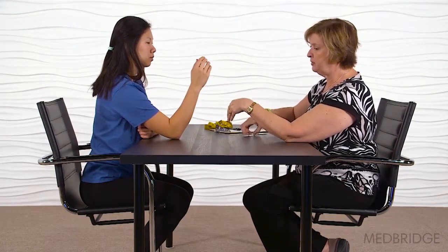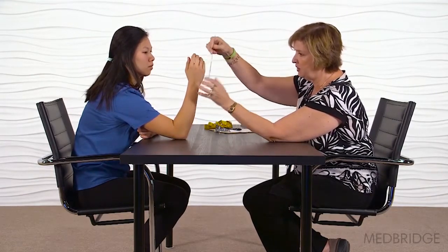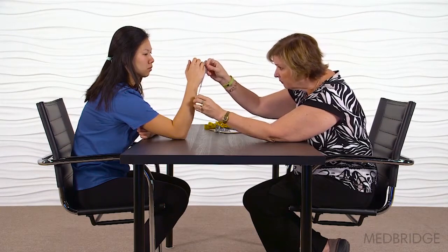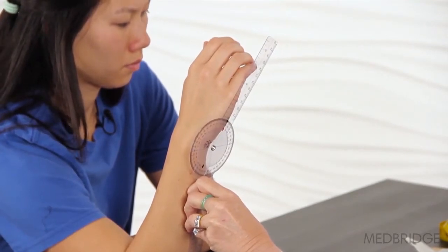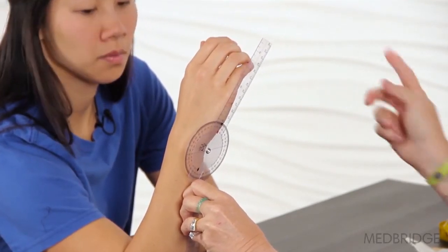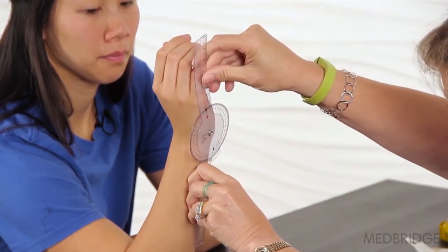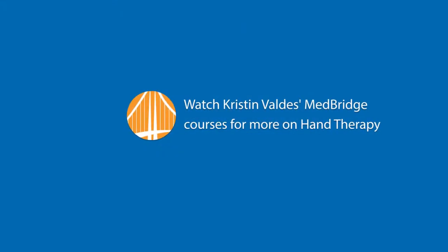Now let's take a look at what your wrist can do. Starting here — and it depends on how your goniometer is — this one I'm going to line up on the joint axis rather than on top because of the way the goniometer is structured. I want you to just flex your wrist forward as far as you can. That's about 30 degrees. And then bring it back the other direction as far as you can — that's about 21 degrees.